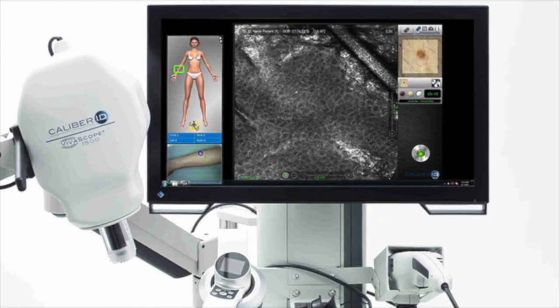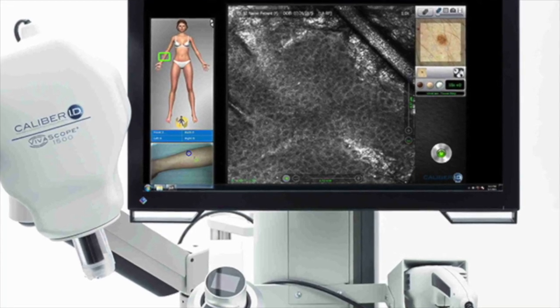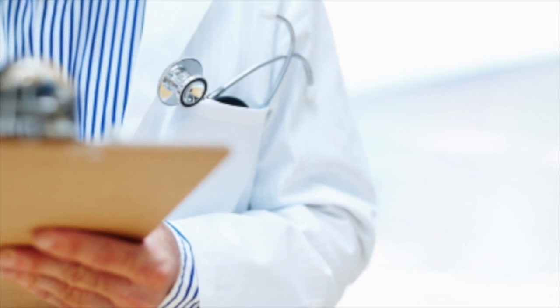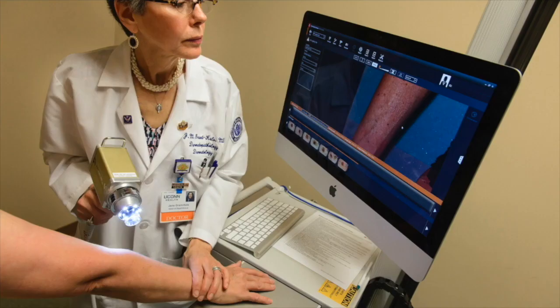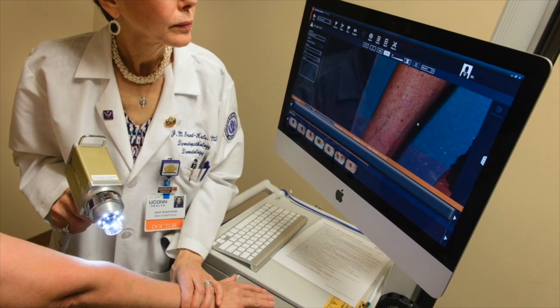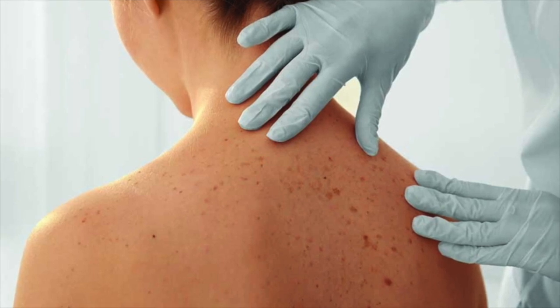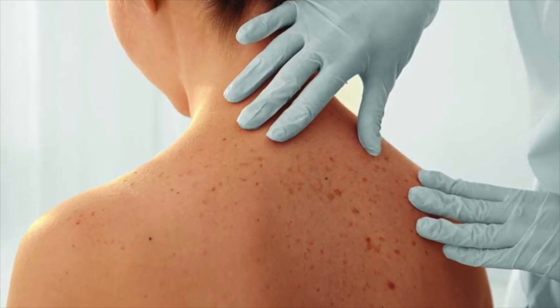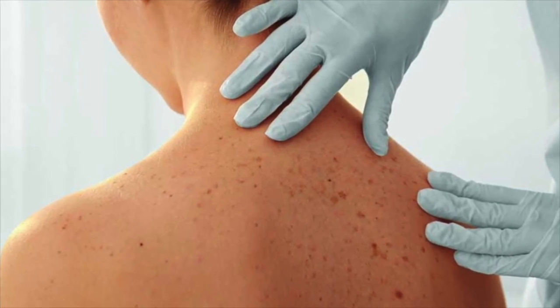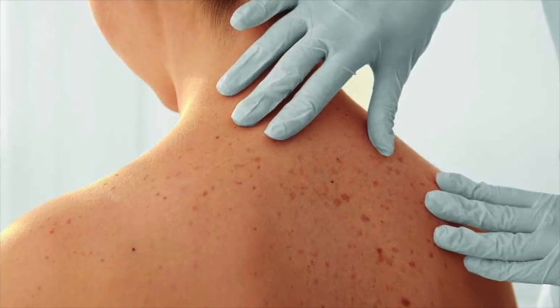Now that we know a little background of the Reflectance confocal microscope and how it works, let's look at how it could actually be used. The Reflectance confocal microscope is a tool of interest today as a diagnostics tool. A case study explains how the Reflectance confocal microscope can be a potential use for skin cancer imaging for clinical use. Expert dermatologists can diagnose correctly around 75 to 80% of skin tumors. Final diagnosis can lead to surgical biopsy, and this can be painful, leave scars, and is time-consuming to have skin prepped for examination for diagnosis.